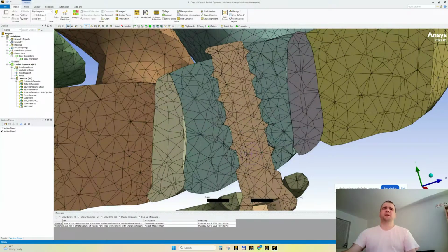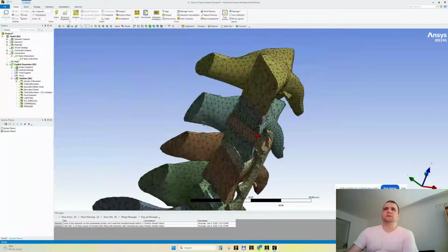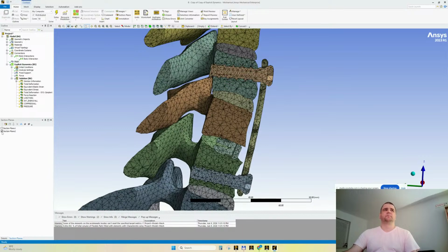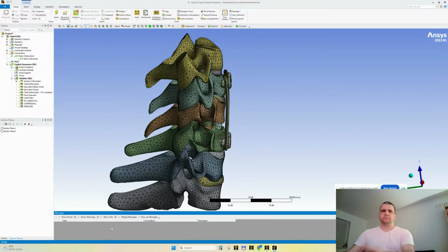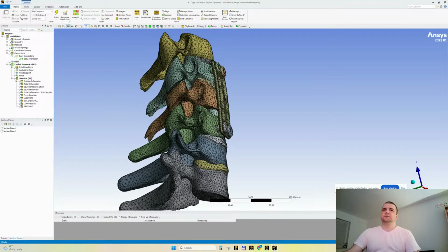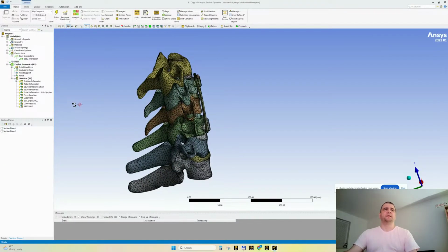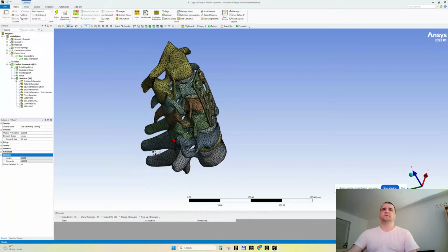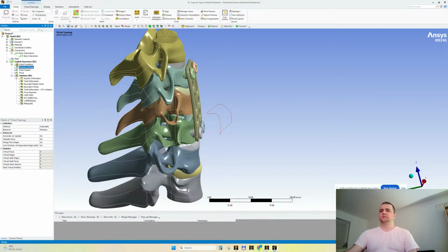They look so nice. I will keep the mesh as default, as it is now, because I don't want to extend the solving time too much. So don't expect a mesh optimization. Feel free to refine the mesh. I don't care about mesh quality at this moment. When you're working in your laboratory, team, research location, whatever, feel free to improve your meshing and the mesh quality. I don't think virtual topology will improve many things. I'm satisfied with what I have. Can I delete virtual topology? Yes. All right. It froze. Yeah, no problem.